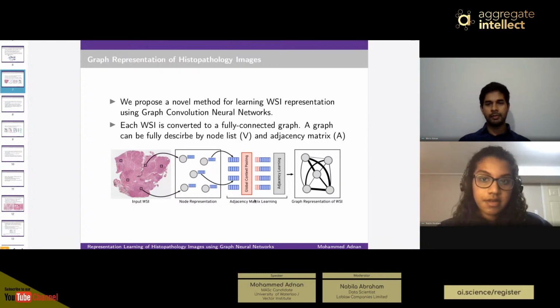It's completely random. Okay. The reason I ask is we've had a similar talk on this stream, where the adjacency matrix was initialized because the training wasn't stable. So between every layer, the adjacency values jump quite a bit. I'm wondering if you see that happening here. Is there any way to constrain the learning of the adjacency matrix? No, we don't put any constraint on the adjacency learning layer.